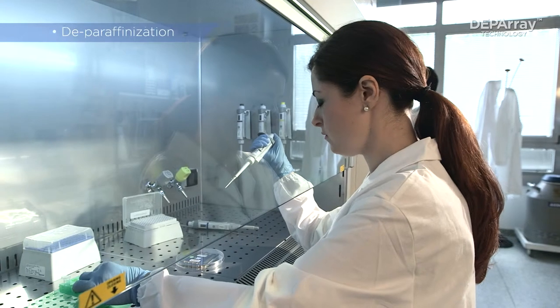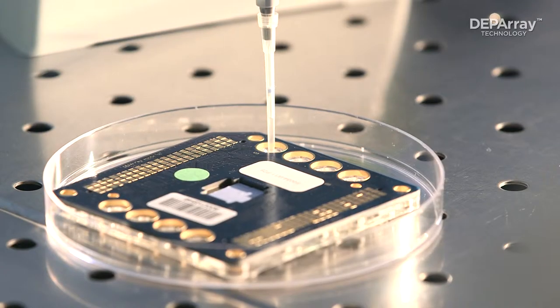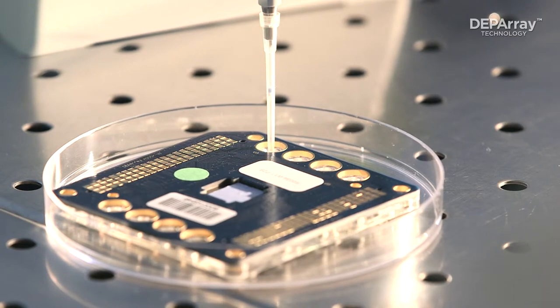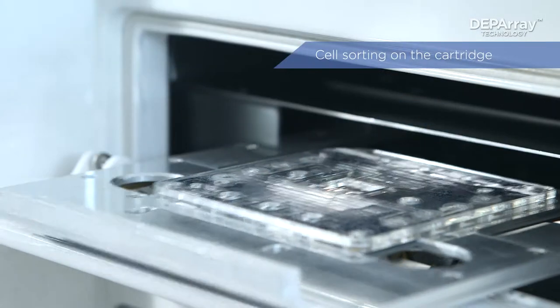The suspension of cells is stained with markers for specific cell types. Stained cells are loaded onto the DEP Array and tumor cells are then separated from stromal cells with 100% precision.